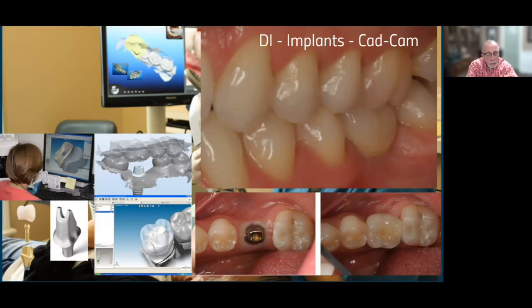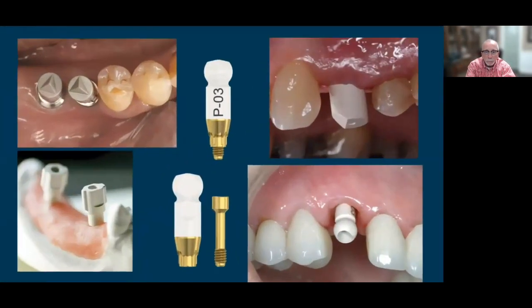And now the GP could certainly have the scanner and do that in his office, right? Which means go to the surgeon, get your implant, come back here. I'm going to put the post in, I'm going to scan you. But that turned out to be a great workflow for the surgeons, for the GPs that don't want to deal with anything other than screwing the abutment in and cementing and putting the crown on top. Then that's a good workflow. It worked out well for us.